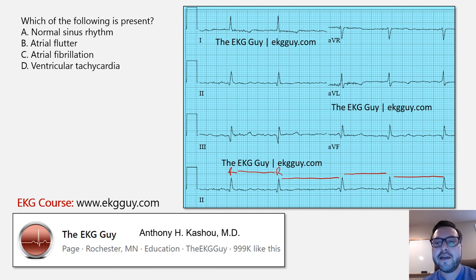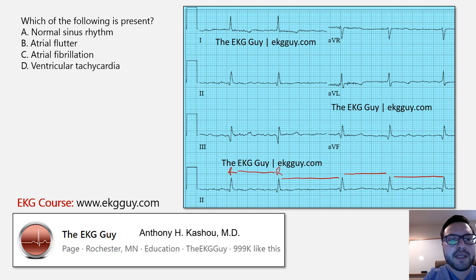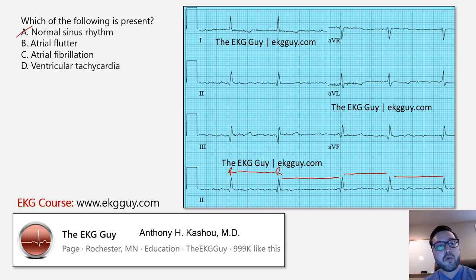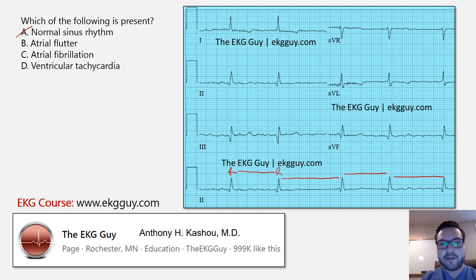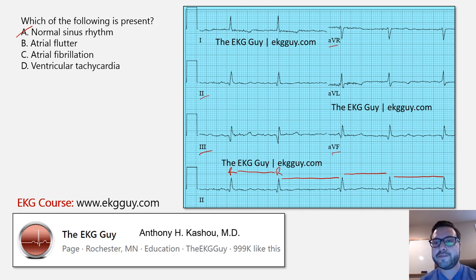Already knowing that, we can eliminate some options. Normal sinus rhythm is a regular rhythm originating from the SA node with organized conduction through. Here, we don't see P waves that we can clearly make out, and we don't see them upright in leads 2, 3, AVF, or inverted in AVR. So sinus rhythm is unlikely given the irregularity of the rhythm and the absence of P waves.